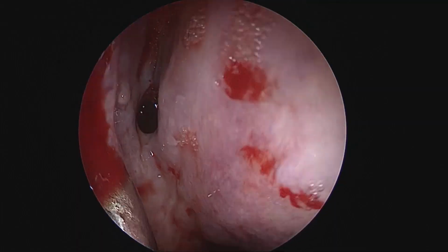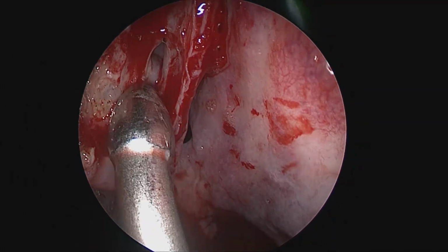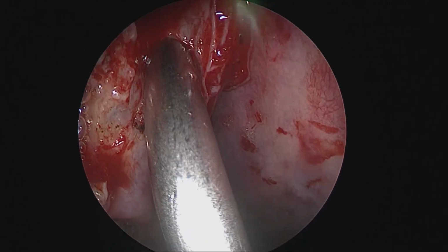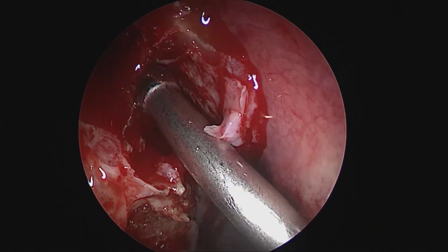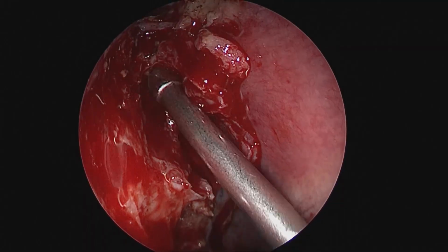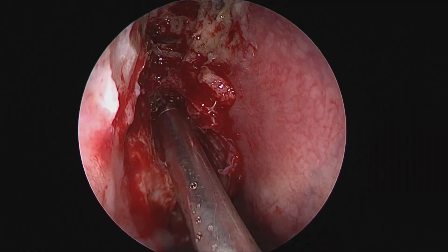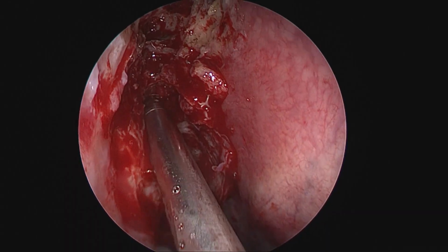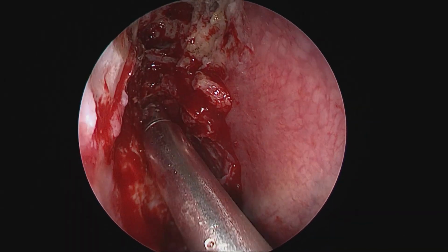In a sort of semi-oncology procedure for a benign or a pre-malignant lesion, one should follow oncological principles and not think of functional aspects of this surgery, because tumor resection is paramount, and with margins, it is very important to avoid future recurrences, which are notorious in this particular pathology.